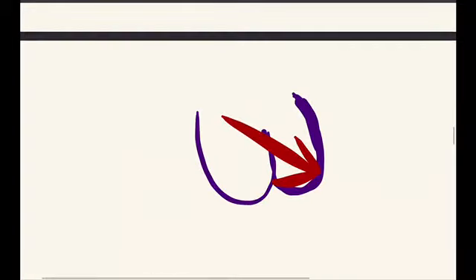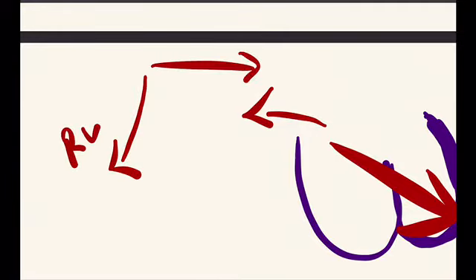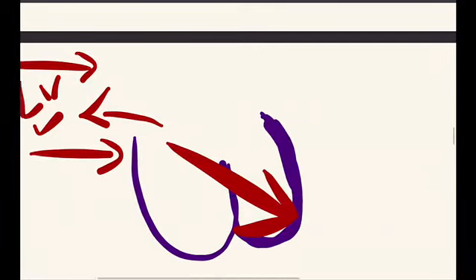This vector is the resultant of two vectors. The first one is because of the right ventricle, and the second one is because of the left ventricle. But the magnitude of the left ventricular depolarization vector is more than the right ventricular depolarization vector. So the resultant vector is this, and the lead which is looking towards this is V6. So the V6 lead will show more of the QRS complex, which can be easily seen in lead V6.